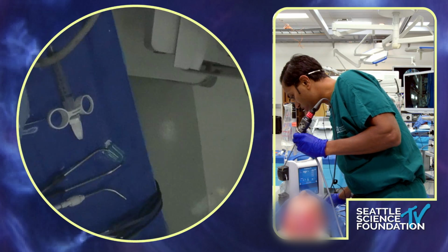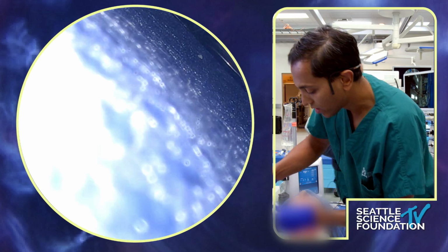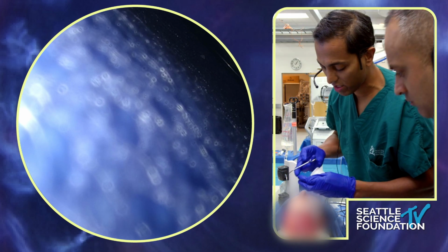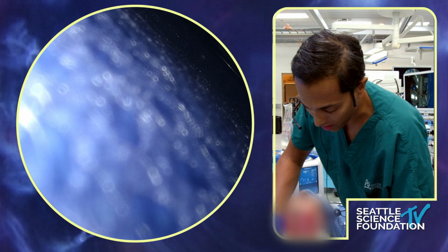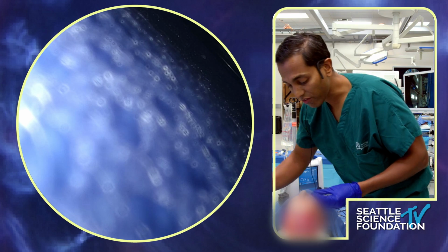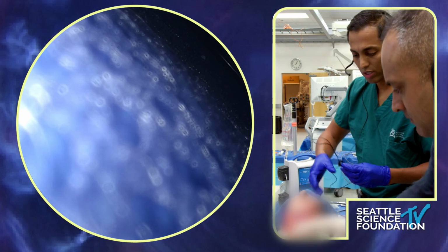So then what you want to do is you will take, what are those scissors? You can take a little bit, like we said, that synthetic graft or whatever we're going to take. And then we're going to take just a Raytec real quick. Thanks. This should be fine. Oh, that's interesting. What's that? Sorry, that was me. Where'd that 45 Blakesley go? Here, 45 Blakesley. Oh, thank you, Arv.